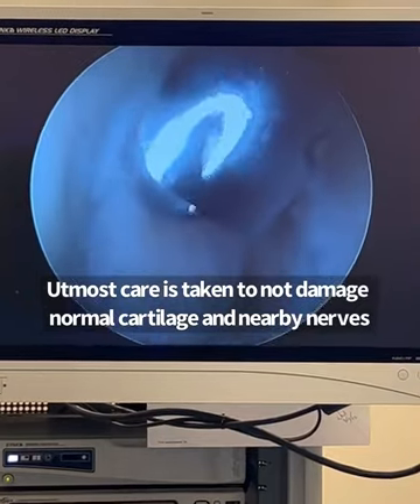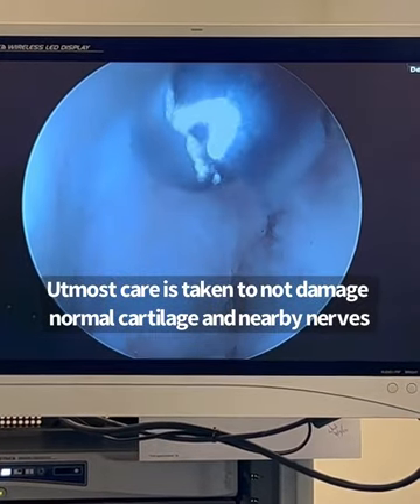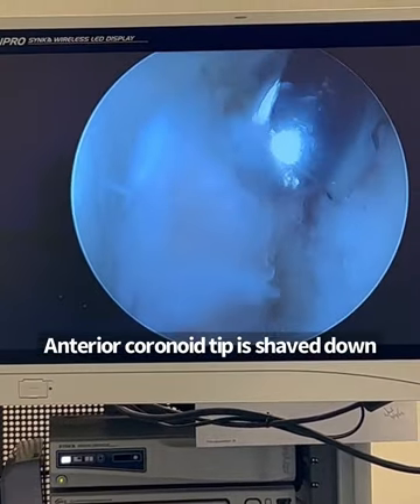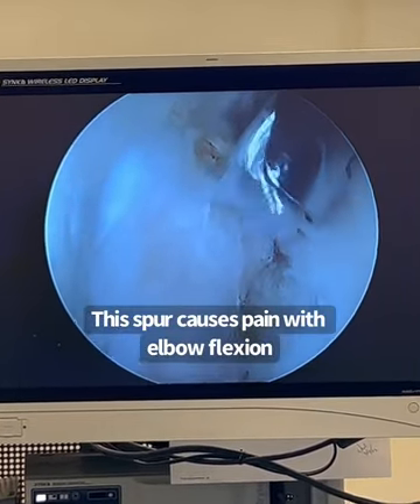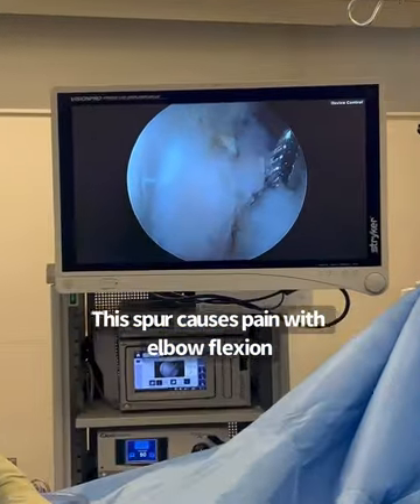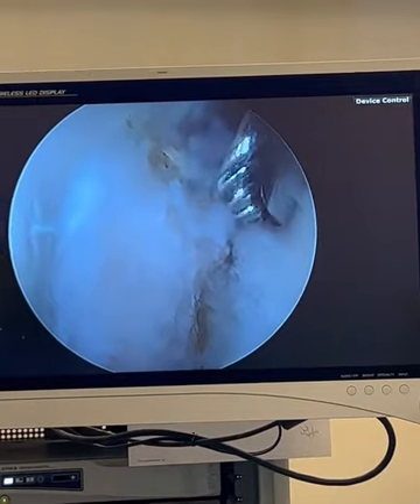I'm removing this little spur of the coronoid over here. I've already removed some loose bodies, and I'm recontouring it. You can see the spur right over here — I'm going to remove that as well.